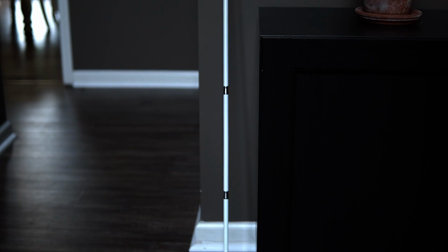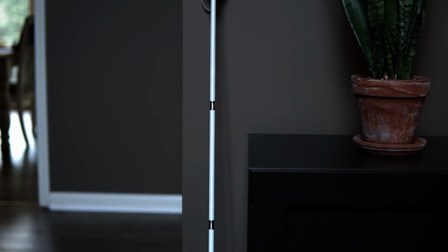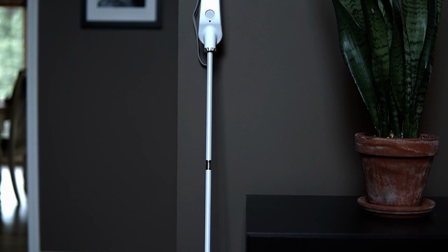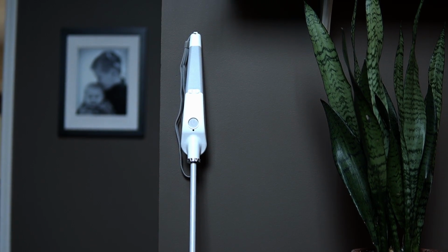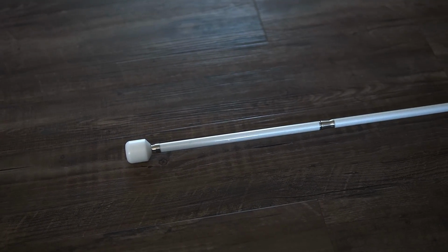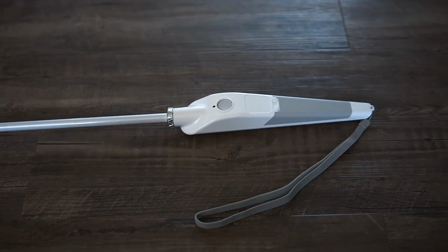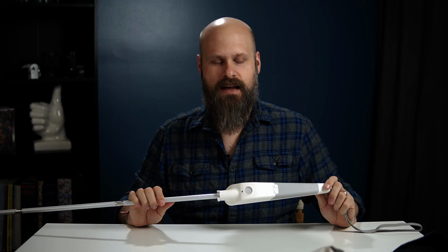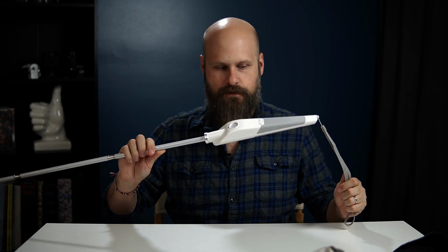So this is a smart cane that uses haptic feedback to detect obstacles in front of you. Now, it's not new technology. There's a couple other devices on the market right now that do something similar, but this is one of the only ones that's implemented this technology into a cane. It's not the first time that's been done. There was an old cane years ago. It was like a laser cane or something. But the WeWalk is one of the latest.